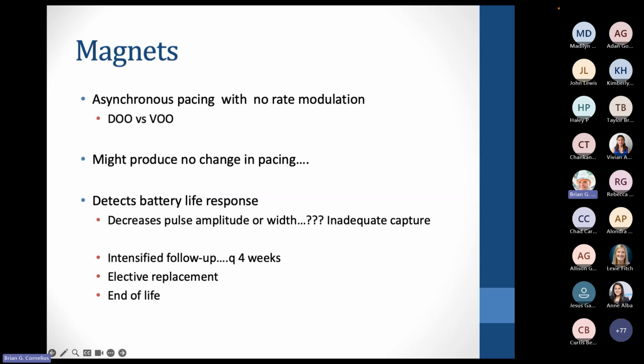If you've never seen one of these magnets, it almost looks like a small donut, and you just set it over top of the patient's pacemaker or ICD. Sometimes it will be close to the surgical field, so you may have to put a big Tegaderm or something like that over top of it to hold it in place, and then they can prep over top of it. Sometimes it's far away from the surgical field, so know what's going on there and know how you're going to intervene. Really, the hardest part of that is finding the magnet a lot of the time.